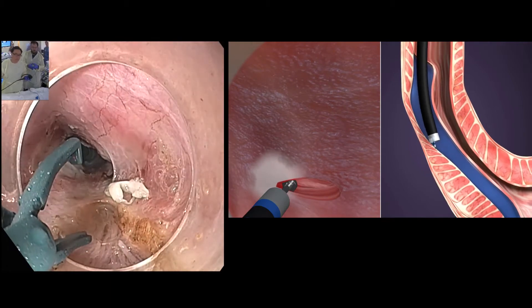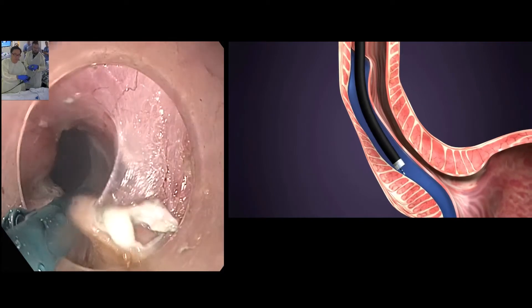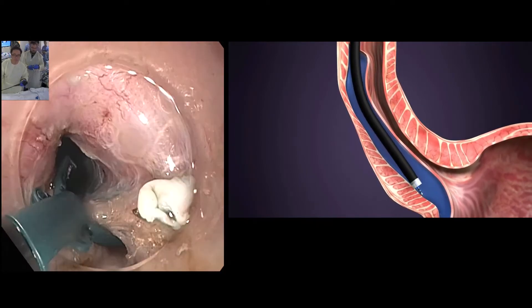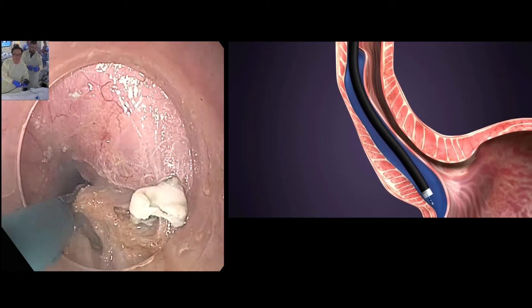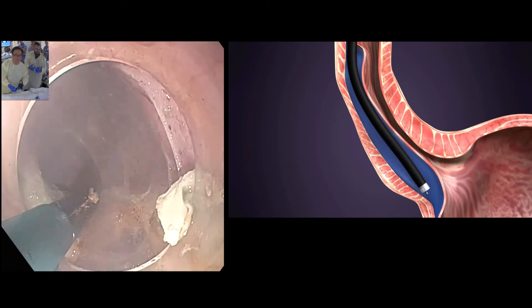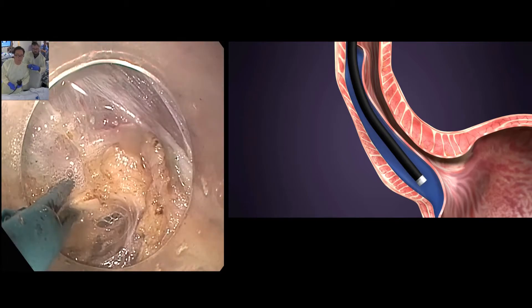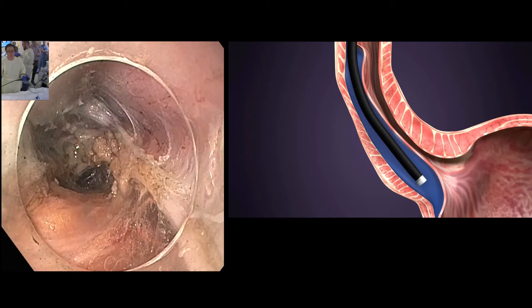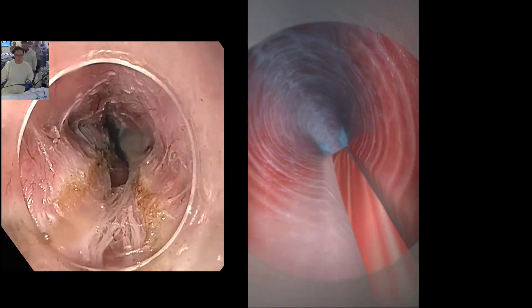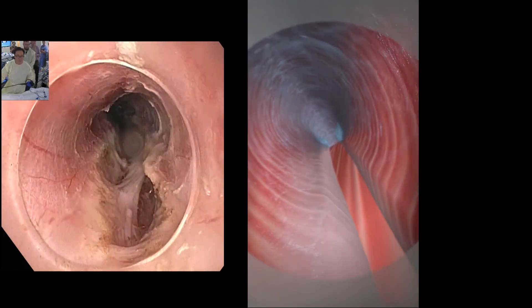Here I am switching to a scissor type device, which allows me to cut both the circular and longitudinal layers of the muscle, which comprise the lower esophageal sphincter. The myotomy, or cutting of the muscle, is extended all the way to the top of the stomach so that patients can swallow much easier after the procedure. Here the scope is being removed from the tunnel. The tunnel will collapse and seal itself, and that's the trick behind it.